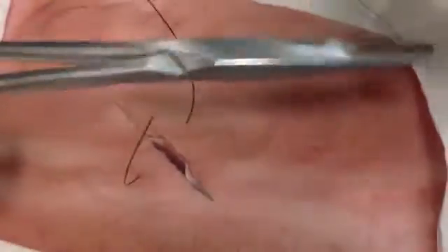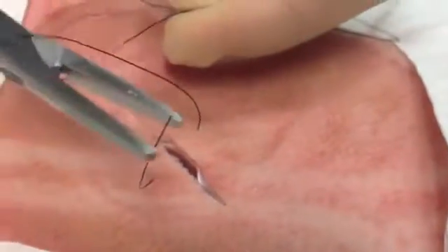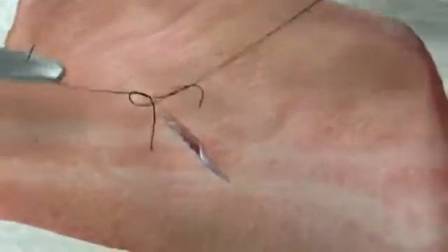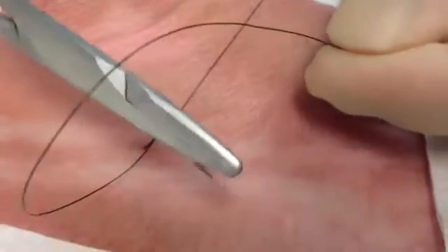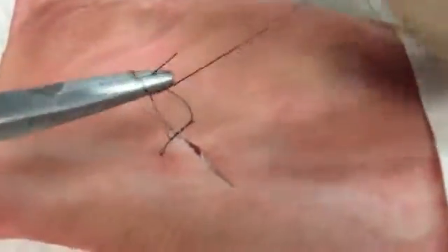Then to tie our knot, we're going to come off from the inside of the wound and loop twice for the first knot, grabbing the free end of the suture, pulling the knot so the edges lie flat as shown. We're going to come from the inside and loop just once on the other side and pull that through.